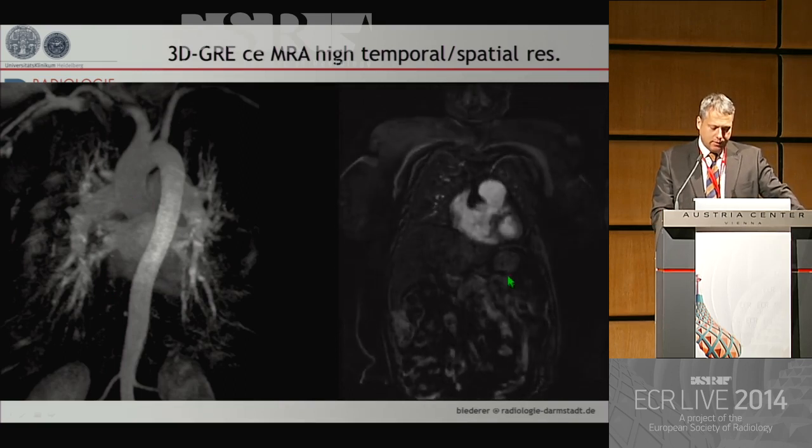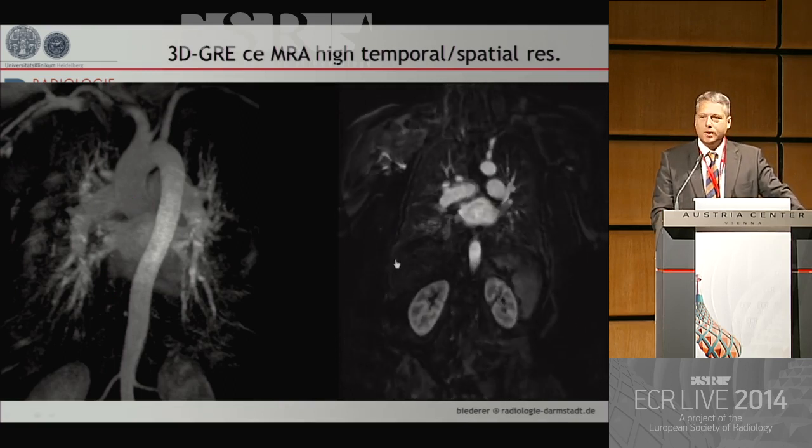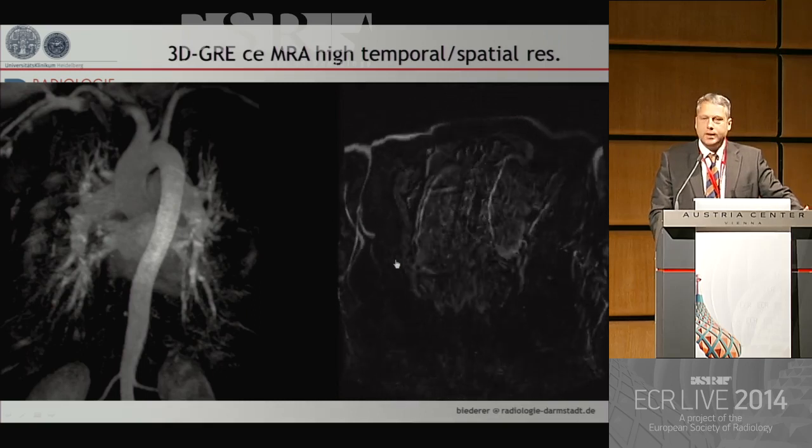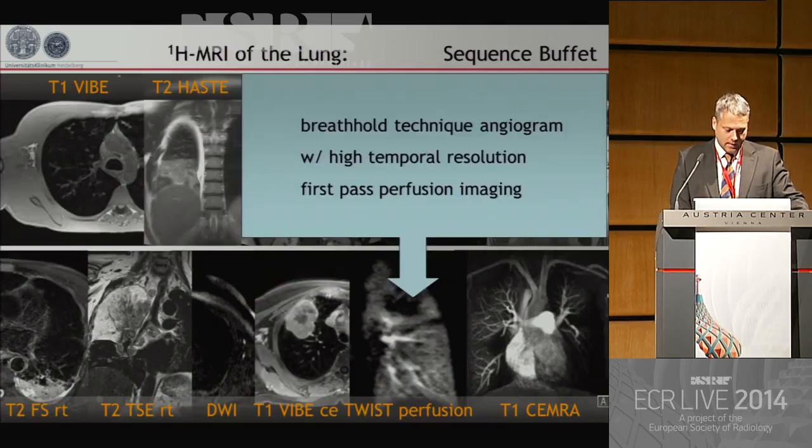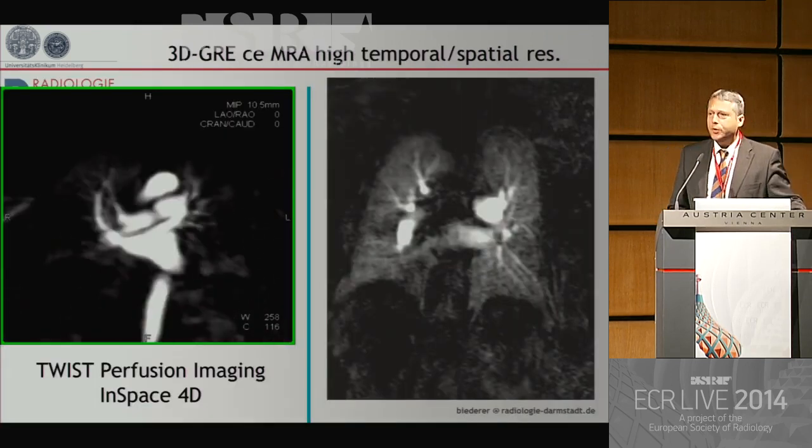And if we just run through the images of this arteriogram on the right-hand side, it gives you a realistic idea of what we could achieve. Press button, of course.